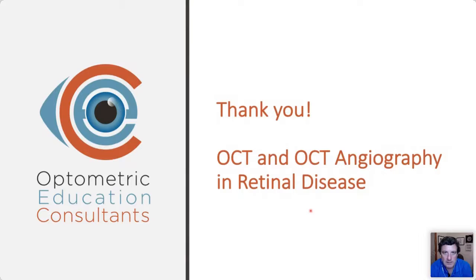Explain that. Well, it's a wellness scan, so the patient actually pays for that out of their pocket. So we offer that when the patient comes in, just like most offices are very familiar with Optomaps. We just add the OCT wellness scan, B scan, and then the angiography to the patient. Now, being a third-party chair for Pennsylvania, I will tell you that if you find something, you just don't say, oh, now we're going to bill it as diabetic retinopathy. The patient had a wellness scan, so they pay for the wellness visit. So we just run wellness on patients, and it's a cash pay, and it doesn't get billed to the insurance.